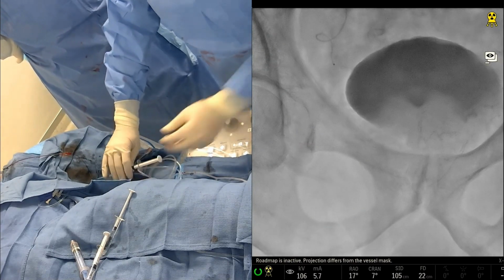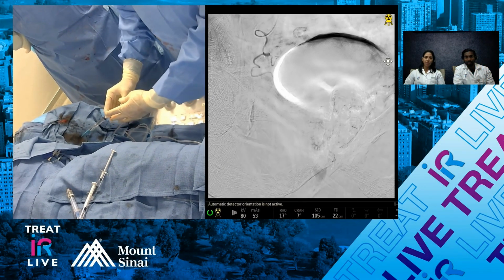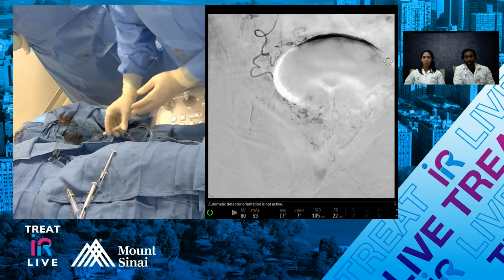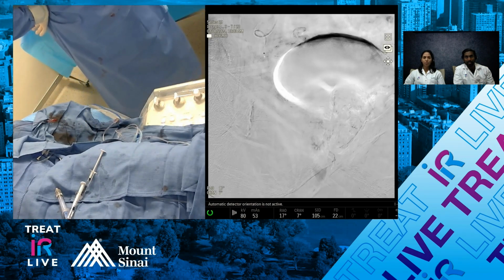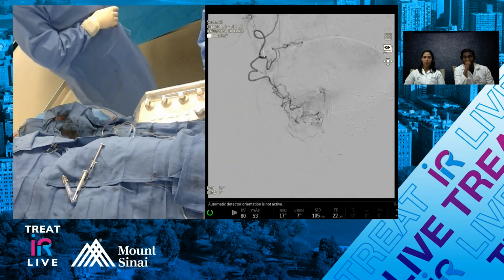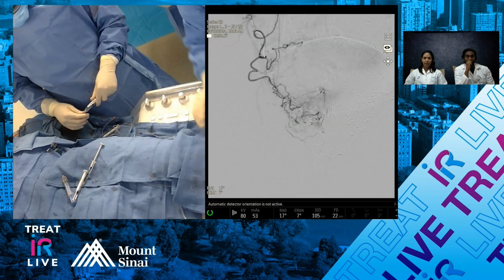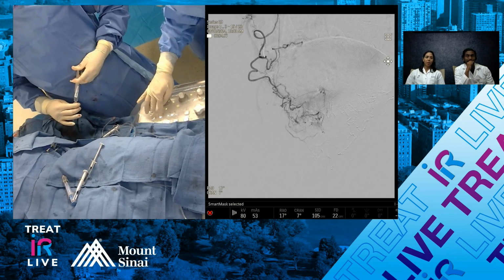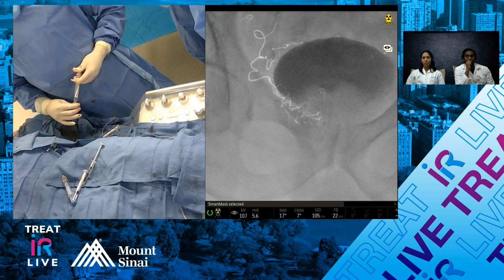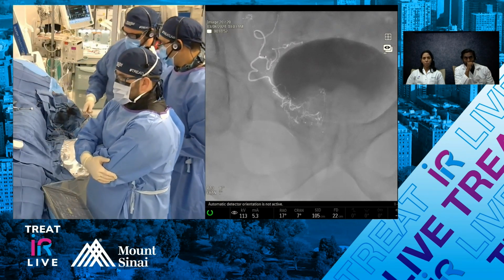When you're not using balloon occlusion, do you try to get the base catheter even closer to provide a little bit of occlusive injection? Interesting. Yeah. We could do a little nitro first. Say that again, Viv. I was just saying, if you're not using a balloon occlusion catheter, do you ever try to drive your base catheter in to provide a little bit of occlusion? We can do that, but I think in this example, we're not going to get it that close.